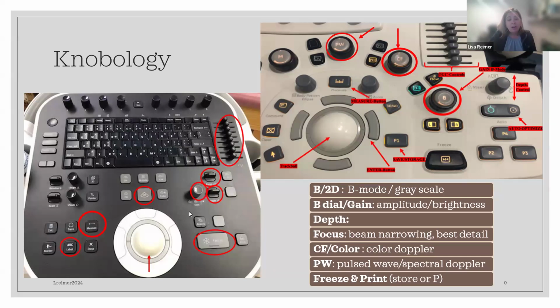You can see it here on the system, and you can see it, I have to move my thumbnail here. You can see it over here on the system on the right. Depth is a great tool to get your image centered. So if your kidney is way up on top and you have all this information that you don't need after it, you can adjust your depth to center it.